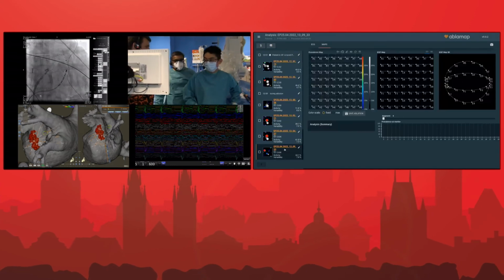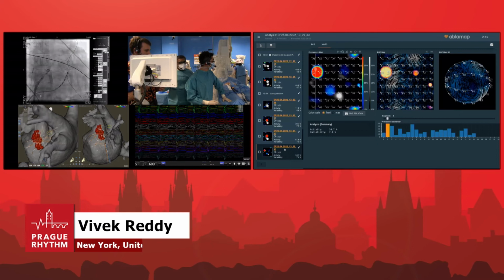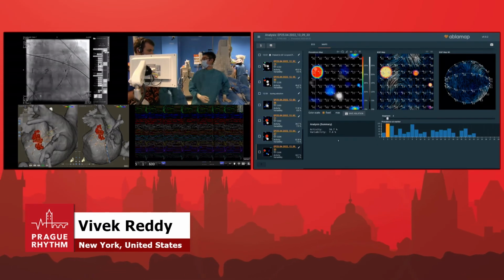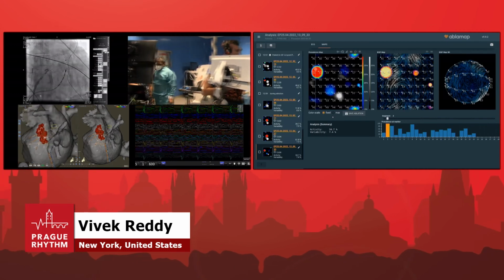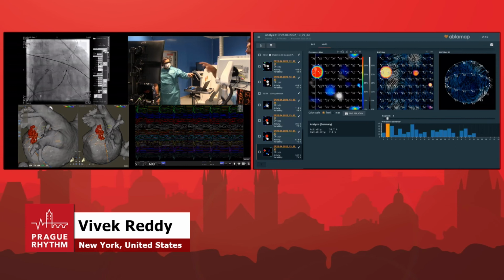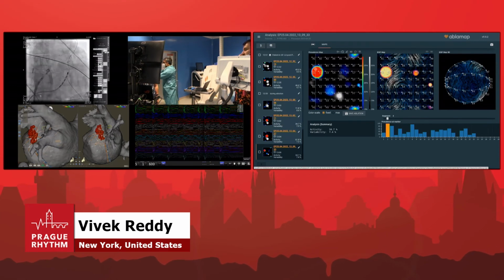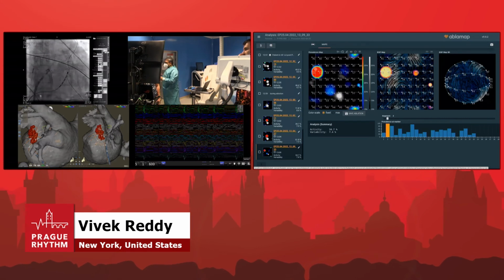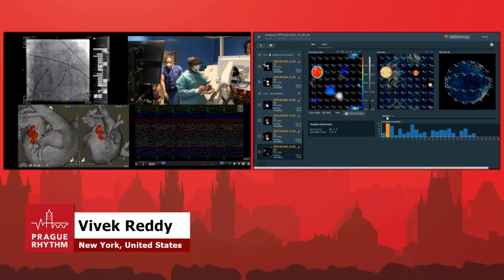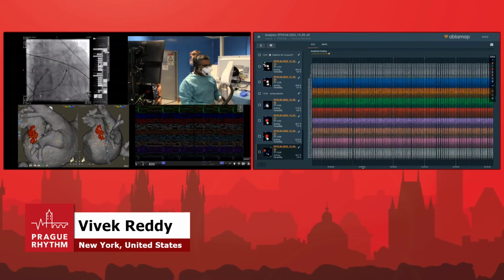So we put the recording basket back, and now we're acquiring another acquisition. Do we have it yet? Okay. So it's still there. Yeah, can we see it on Cardo now? I have a question how you can see now any signals, because after this pulsed field it should disappear. Yeah, the signals completely disappear.